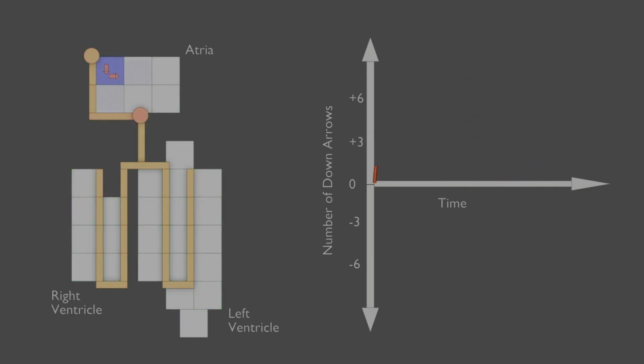So for right now, we're going to name this normal sinus rhythm. And that's because the pacing impulse, that one cell that fires first, is originating in the SA node, the sinoatrial node. And then everything that's happening after it is the stuff that we expect. That's what makes it normal sinus rhythm, at least for our purposes right now. I'm going to put a whole bunch of commentary on language with that a little bit later on.